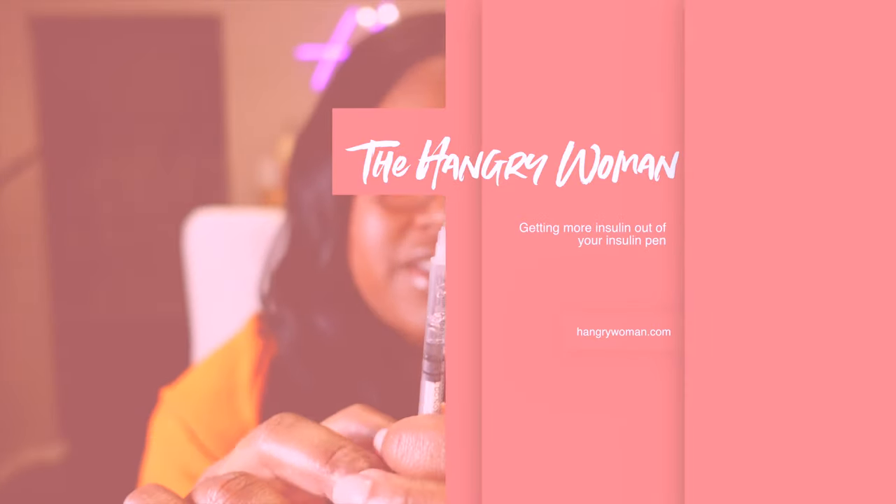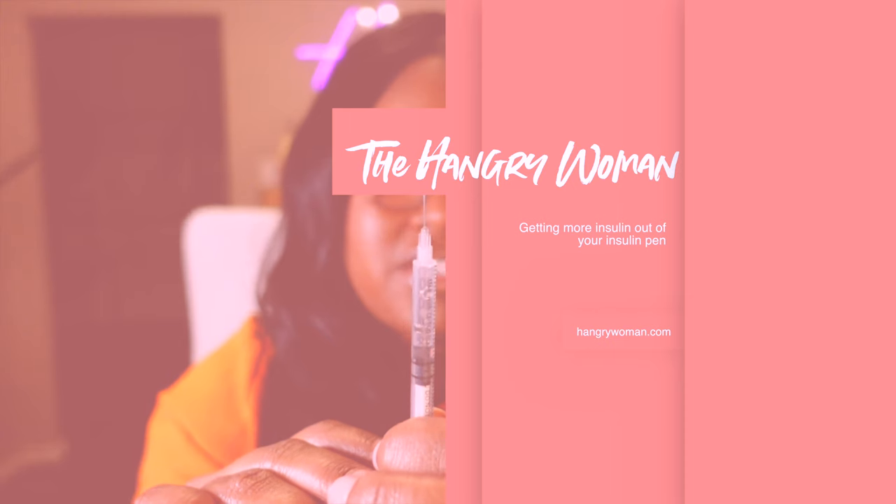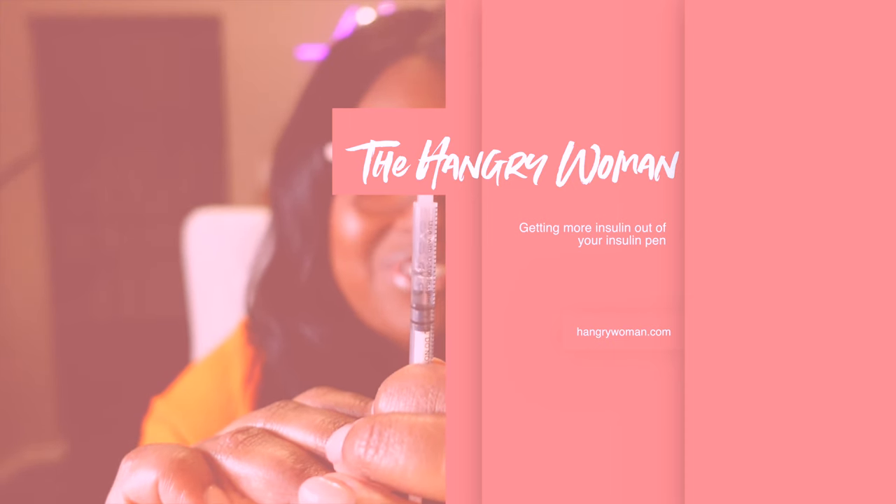Hey guys, Mila the hangry woman here, and today I'm going to show you a really interesting hack that I found with my insulin pens. There's still some insulin left in your insulin pens when you are finished with it or it looks like it's spent, and I found a way to actually get that extra insulin out of there. It's quite interesting and also quite easy, especially if you've used syringes before.